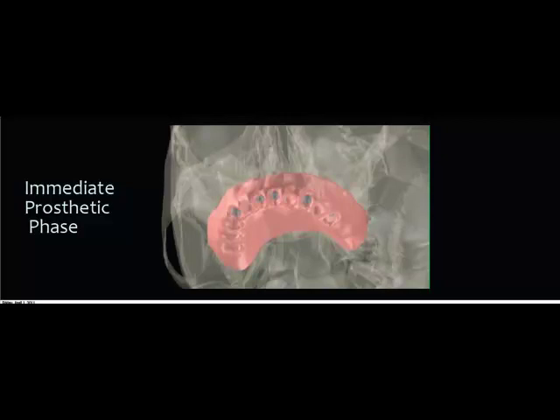A very important step, and probably the most important step in this whole process, is the patient's occlusion. We've actually added to our protocol the use of a digital analysis of the patient's occlusion, utilizing a system that helps us quantify the patient's forces of occlusion in various areas of their bite to make sure it's properly balanced.